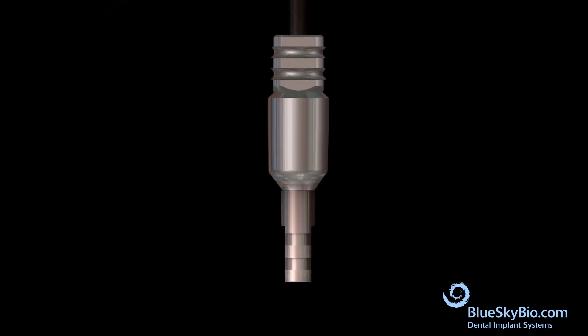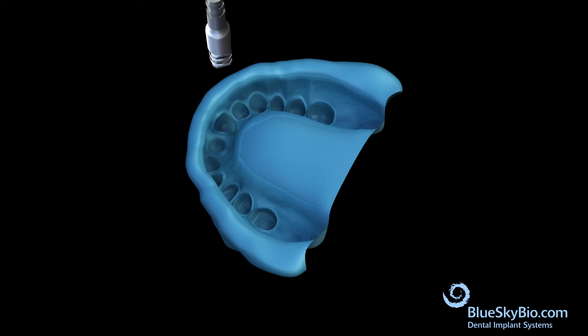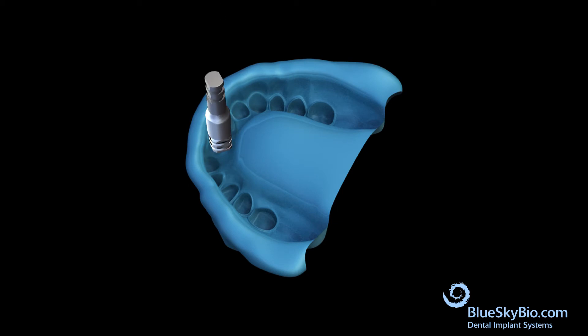Attach the multi-purpose abutment to an analog. Orient the multi-purpose abutment and analog assembly so that the flat surfaces of the transfer match the flat surfaces in the impression, then fully insert into the impression.